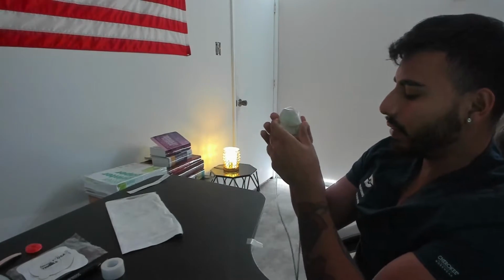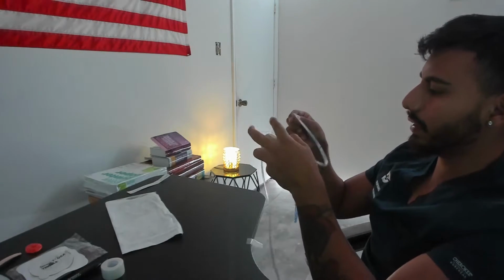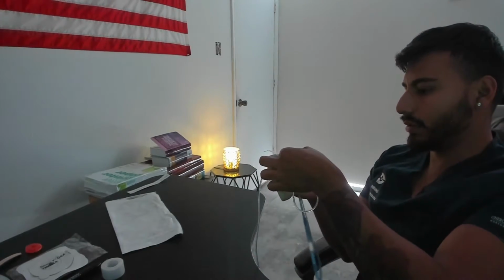Once I do that, I want to use my other piece of tape and attach it to the gown. If this was me, I would attach it just like that. I don't want to attach it too tight. I want to give it some room like this. And then I would pin the tape, not the tube.